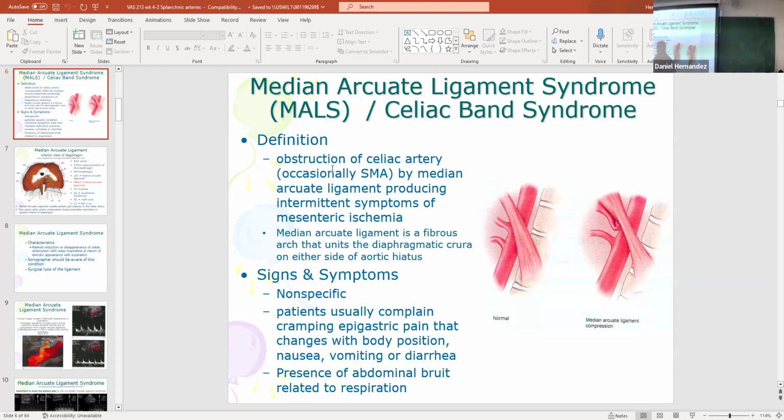It causes ischemia. Yeah, you're creating a high-grade stenosis in the celiac artery. So all the organs that are being supplied blood flow from the celiac artery, so the hepatic artery, the liver, the left gastric artery, blood flow going to your stomach, to your spleen, all get momentarily compromised. It's also positional as well. If a patient's lying down versus sitting up, this can also affect the velocities.